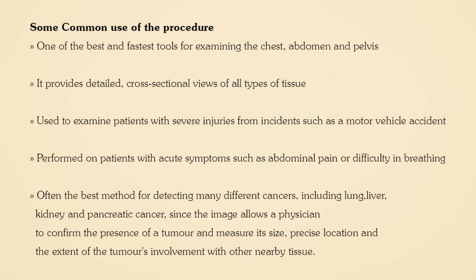Now, we are going to see some common uses of the CT procedure. CT is one of the best and fastest tools for examining the chest, abdomen and pelvis. CT provides detailed cross-sectional views of all types of tissues. CT is used to examine patients with severe injuries from incidents such as a motor vehicle accident.